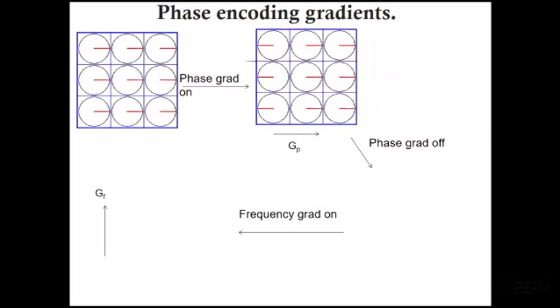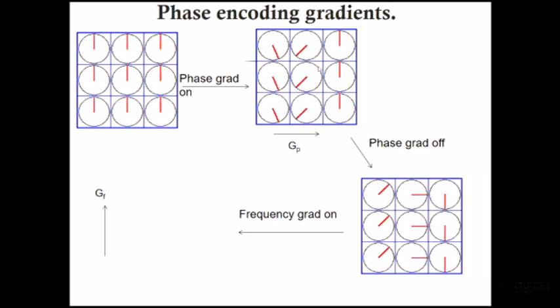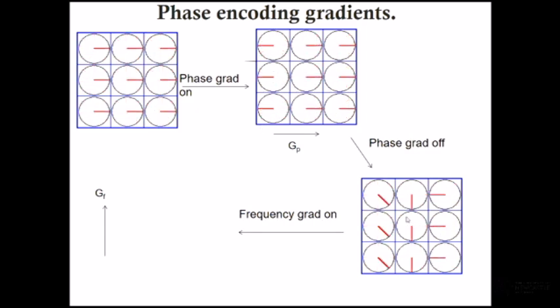If we turn on a phase encoding gradient, I've now got this column all travelling at the same speed, so I can now pull this image apart into 3 different columns. If I turn another gradient on, I've now turned this one, where they all look the same, from columns into columns and rows.